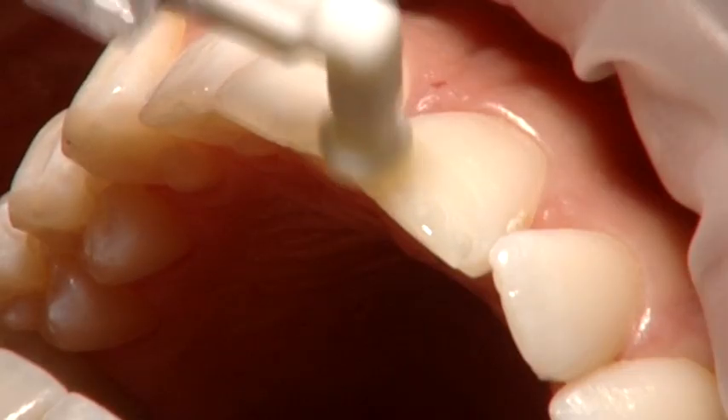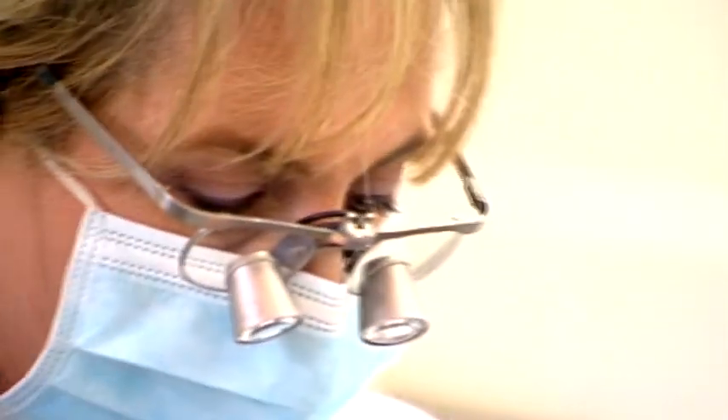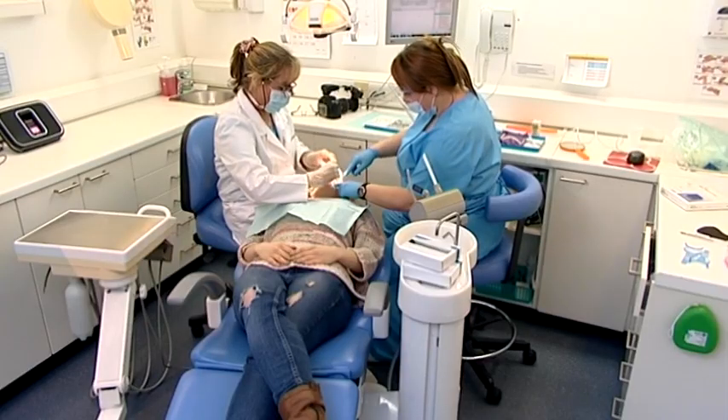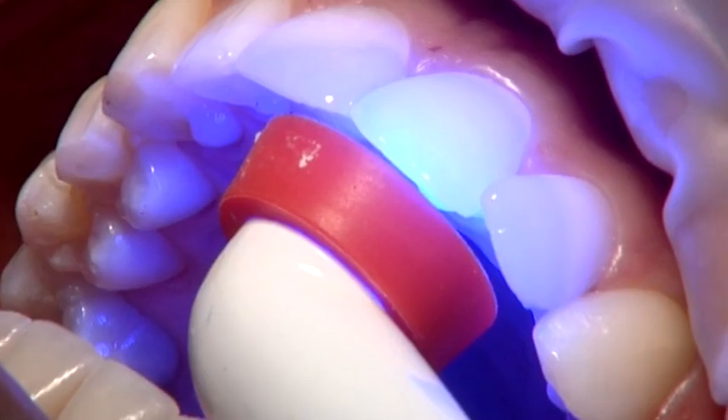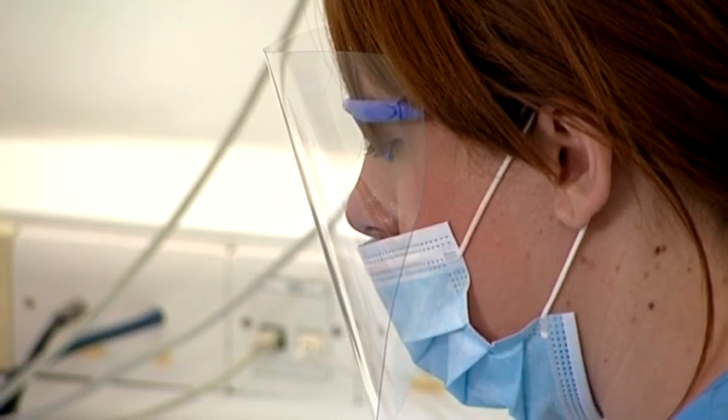The third stage is the most important stage. That is the infiltration of the resin, which takes place to seal either the decay or to seal the white spot. The white spot is defective enamel, so it has some open pores, and the hydrochloric acid opens the pores so that the resin can infiltrate deeper and seal the lesion.